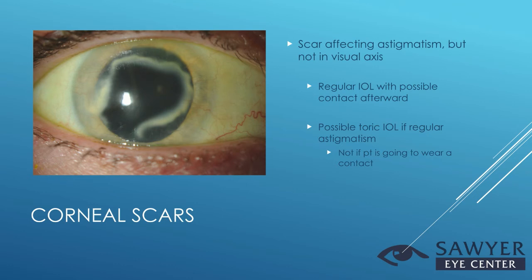So in essence, they will no longer have any astigmatism. However, if you put a scleral lens in front of a toric intraocular lens, all of a sudden you've uncovered their internal astigmatism with that intraocular lens. And now the person is going to need glasses on top of their scleral contact, or some very expensive and specialized scleral contact that can also contain astigmatic correction.